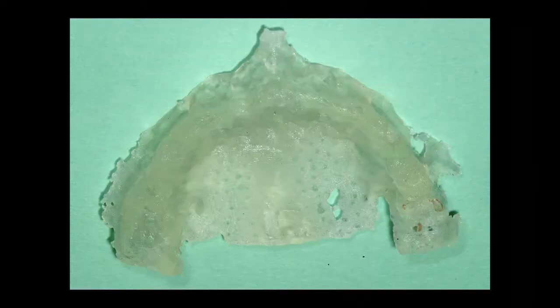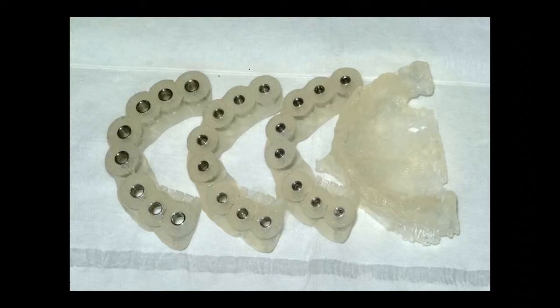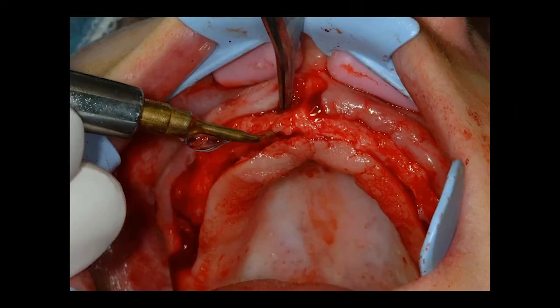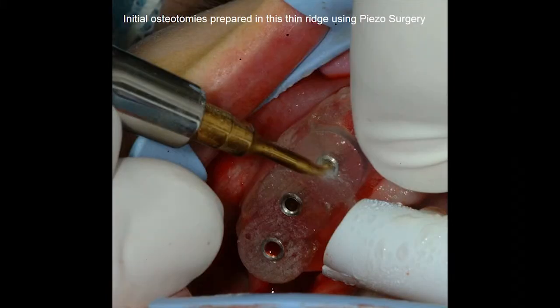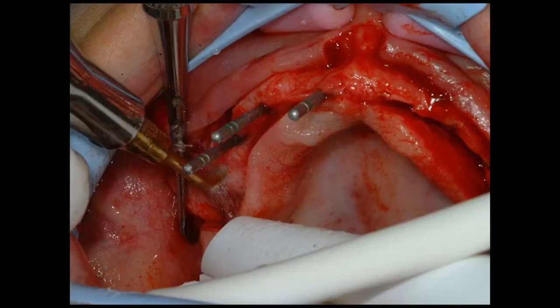And like I said, I've been burned a couple times, and so has my partner. So I trust it, but I only trust it if this locks onto the jaw. And so we go to the mouth, flap everything, got this locked into place. And what we're going to do is we're going to use a piezo to do the initial osteotomies instead of a drill, just because it gives us more control and it gives us a smaller point of entry. So we're going through the guide with the piezo and looking through the window too. I can see where I am.